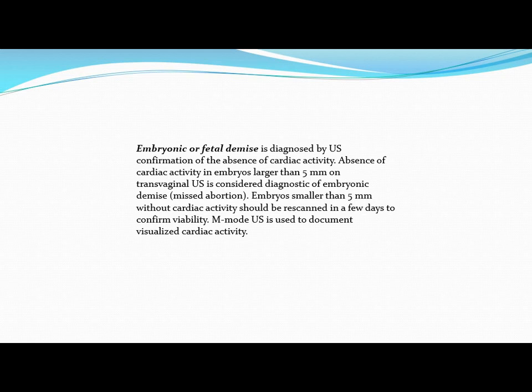Embryonic or fetal demise is diagnosed by ultrasound confirmation of the absence of cardiac activity. Absence of cardiac activity in embryos larger than 5 millimeters on transvaginal ultrasound is considered diagnostic of embryonic demise. Embryos smaller than 5 millimeters without cardiac activity should be rescanned in a few days to confirm viability. M-mode ultrasound is used to document visualized cardiac activity.